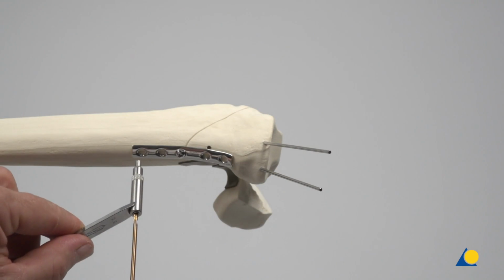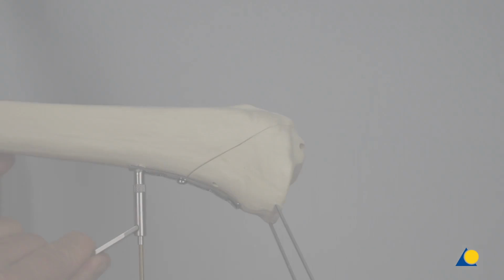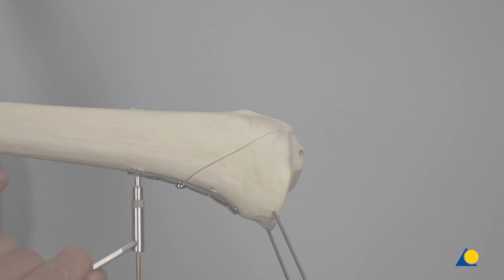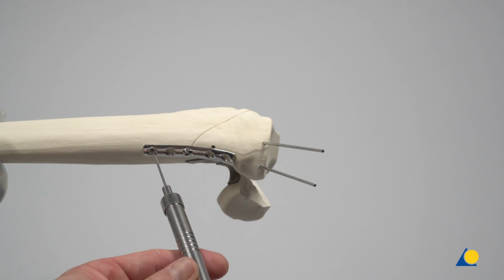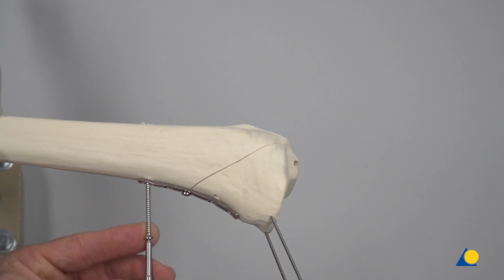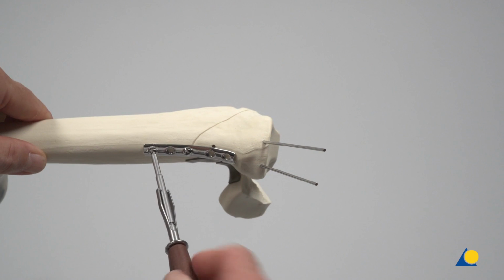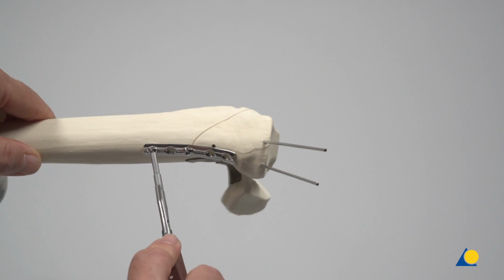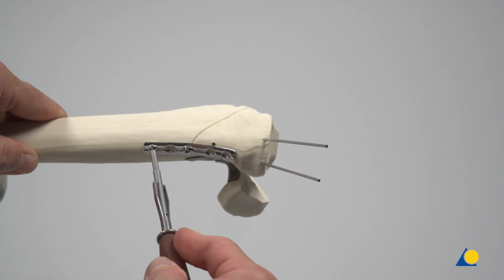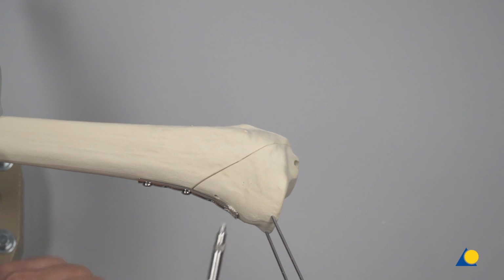The universal drill guide 2.5/3.5 and the drill bit 2.5 are used to drill through the most distal plate hole. The depth is measured, and here a second 36 mm cortex screw is inserted, initially under power with the hexagonal screwdriver shaft and final tightened with the hexagonal screwdriver. The screw insertion steps are repeated on the most proximal plate hole.